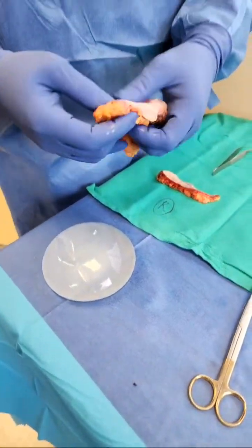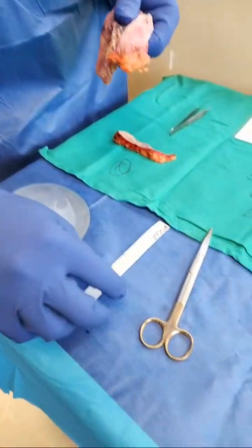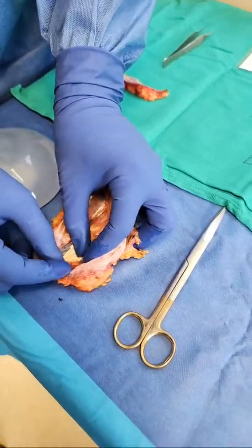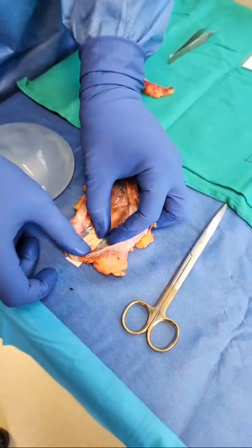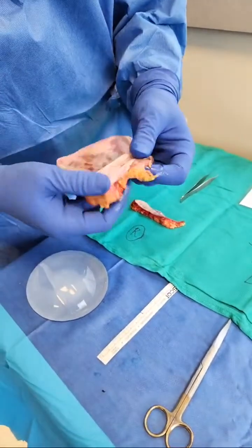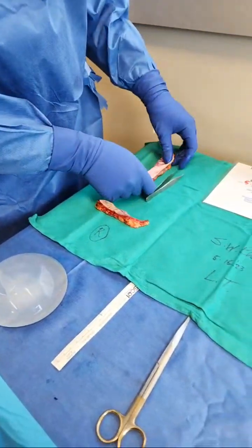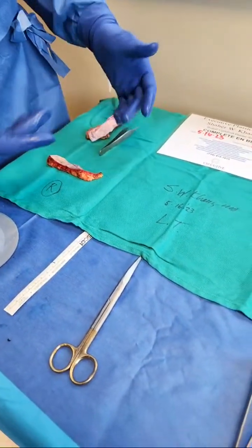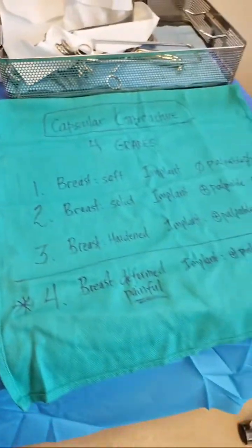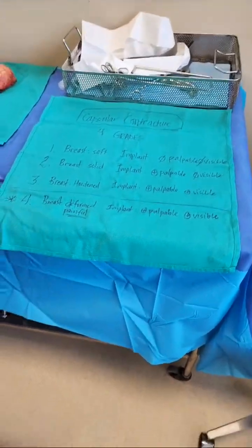And let's look at the capsule. Super ultra thin. And again, as you have seen me do this, no matter how thin the capsule, the entire capsule must be removed. That's the whole etiquette of it. You see how thin this is? The entire capsule must be removed. And as you can see, we'll see what the pathologist says. And all of it was released very nicely with minimal blood loss. Now what I'm going to do is change my gloves. And again, you can focus on the grade 4 types of capsular contracture.